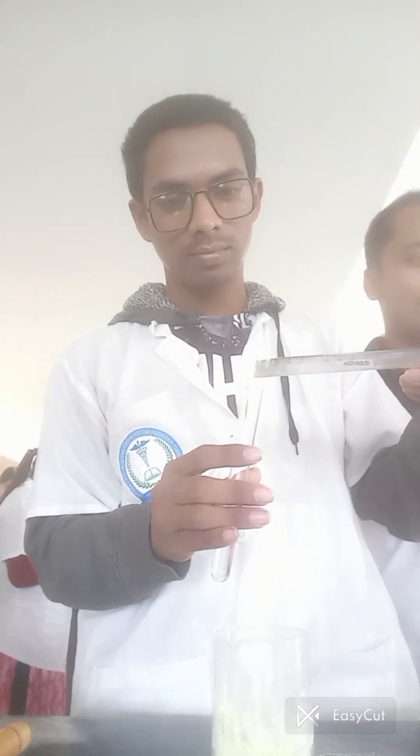Now we will use the other test tube for the test. We are adding 5 ml of urine sample into it. After adding the urine, we then add a pinch of sulfur powder to this test tube as well.